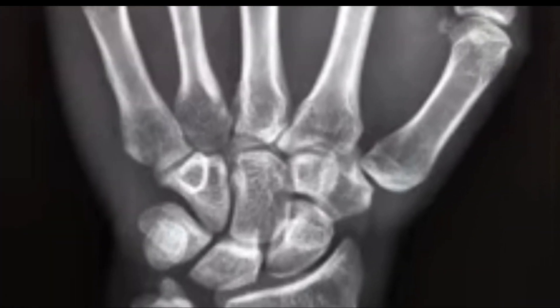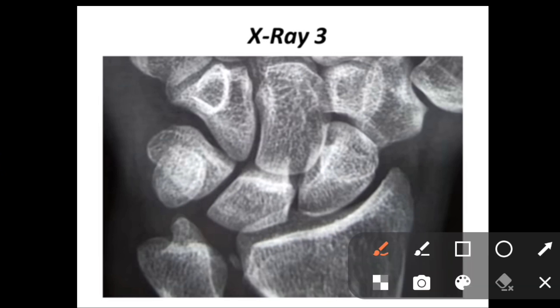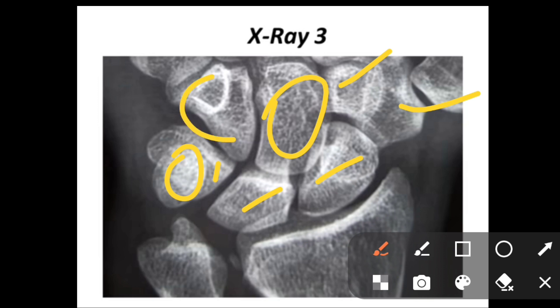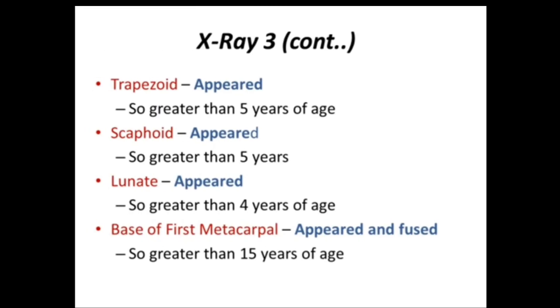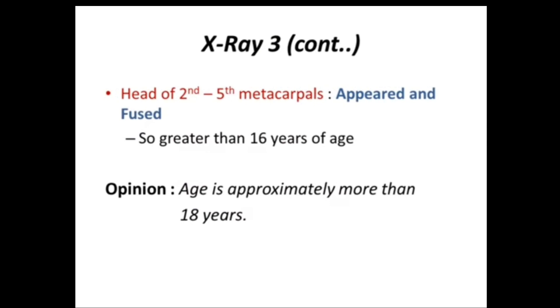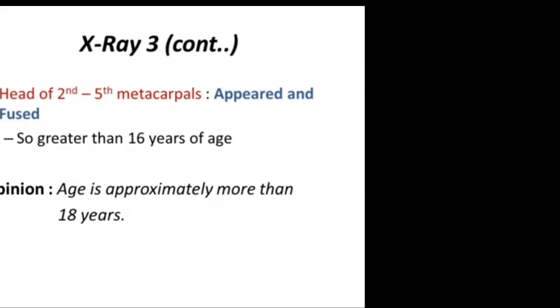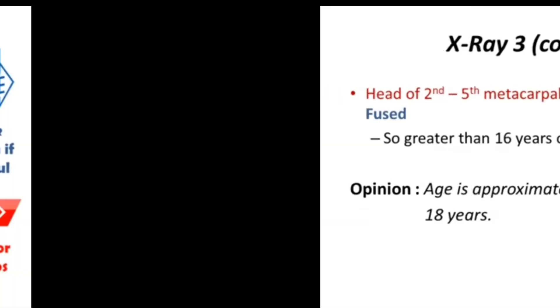The base of the first metacarpal is fused — fusion occurs at 15 to 17 years. Lower end of radius appeared and fused: greater than 18 years. Lower end of ulna appeared and fused: greater than 17 years. All carpal bones appeared including pisiform: greater than 11 years. Base of first metacarpal appeared and fused: greater than 15 years. Head of second to fifth metacarpals appeared and fused: greater than 16 years. Opinion: the age is approximately more than 18 years, as every bone has appeared and every ossification center is fused — completion of the wrist joint occurs at 17 to 18 years.